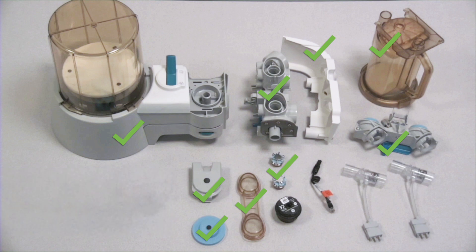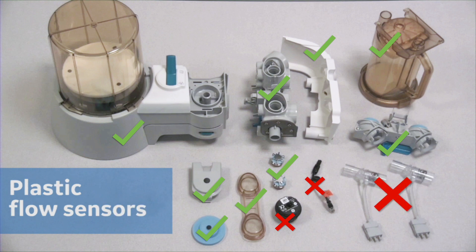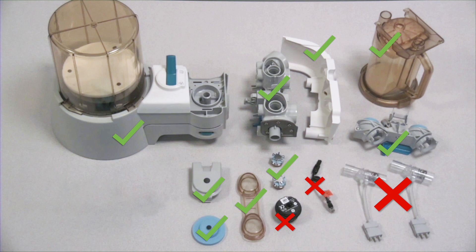Items that are not autoclavable include the O2 cell and the O2 cable, as well as plastic flow sensors. However, if you have autoclavable flow sensors, these can be autoclaved as well.